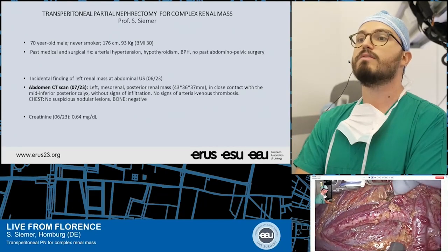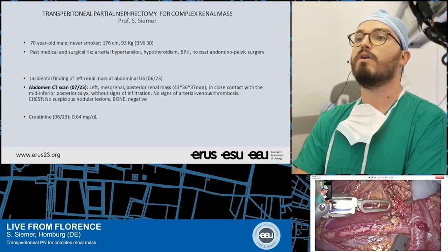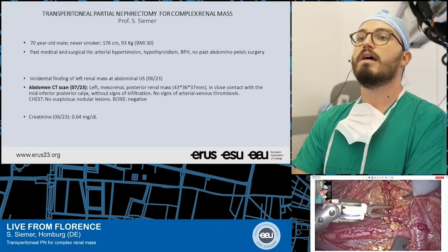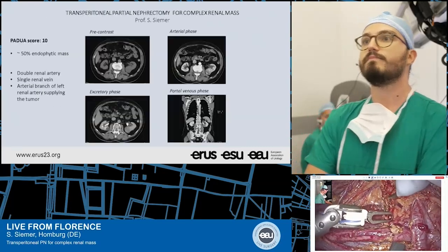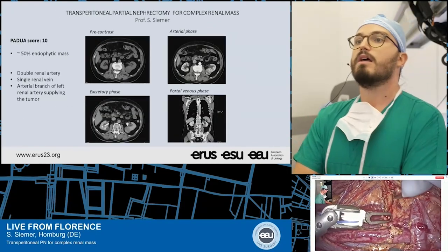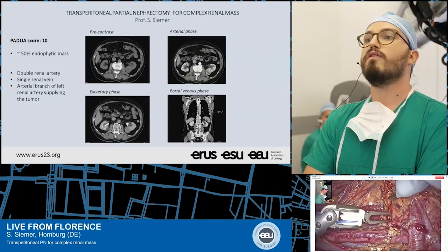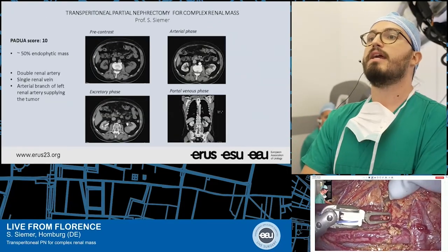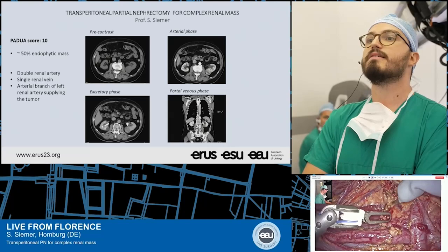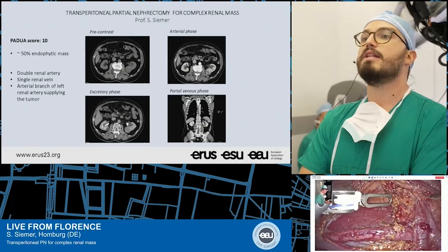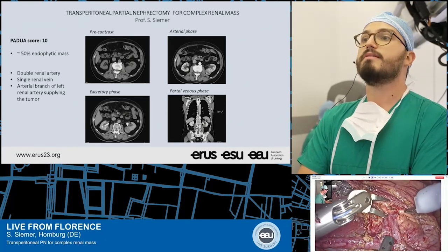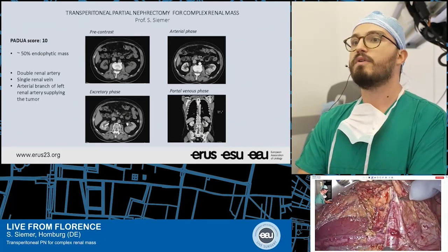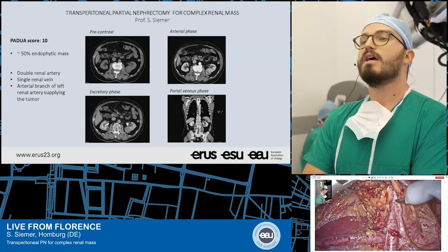Last creatinine was 0.64, in June 2023. These are the four phases of the abdominal CT scan that show different aspects of the left renal mass.